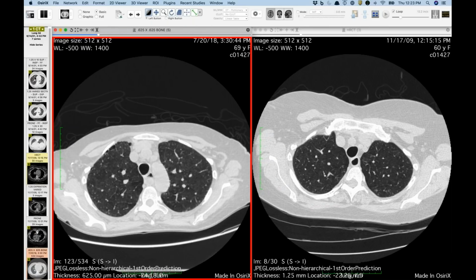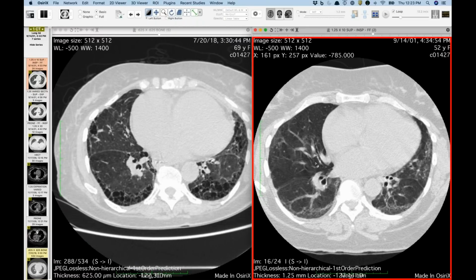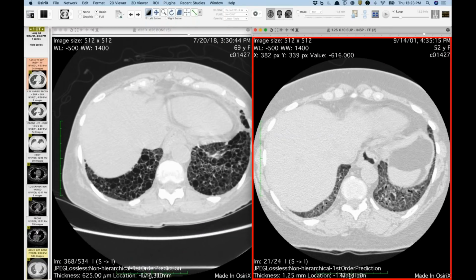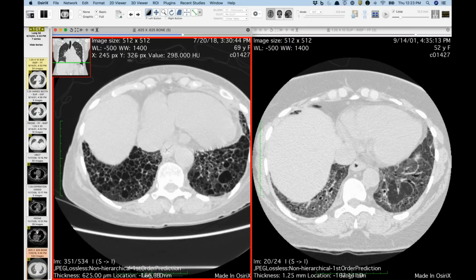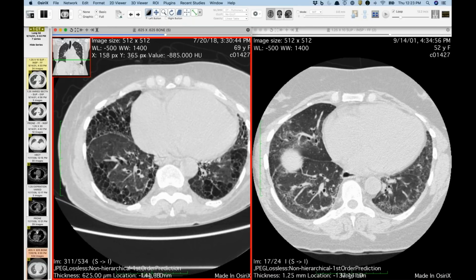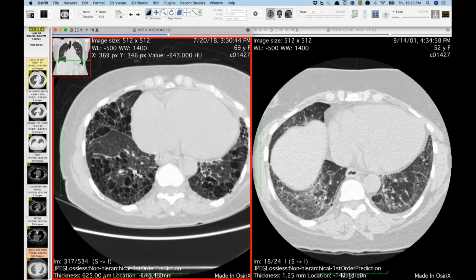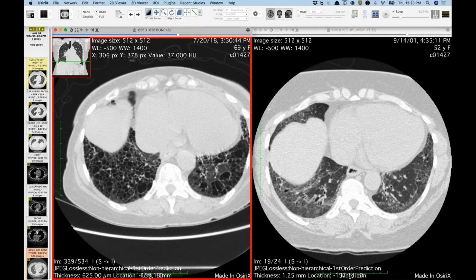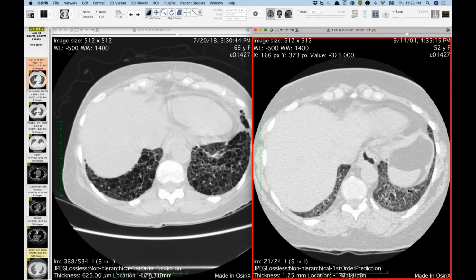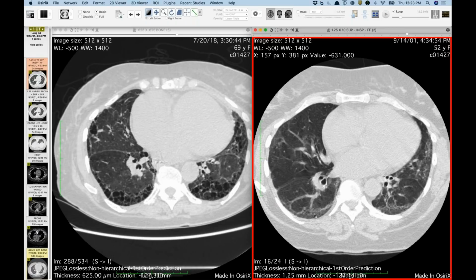What's really cool is I was able to dig up a study from 2001, and you'll see here that it's clearly an NSIP pattern, and maybe little bands of organizing pneumonia too. I like to call this the definitely not possible UIP, because you see these cysts and you're struggling. It's not a possible UIP pattern. It's either UIP or it's inconsistent, whether you think it's honeycombing or not. We've had a few of these go to explant, and it turns out this is all just end stage NSIP, maybe some cysts from LIP. But this is the best example I have, because now I have 18 years of evolution of these findings.